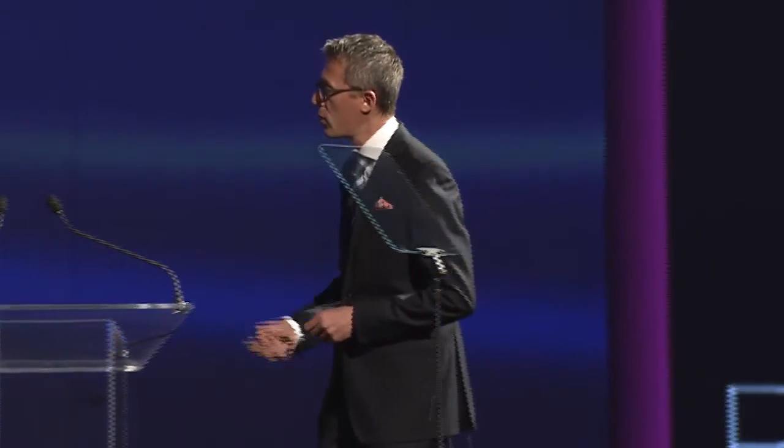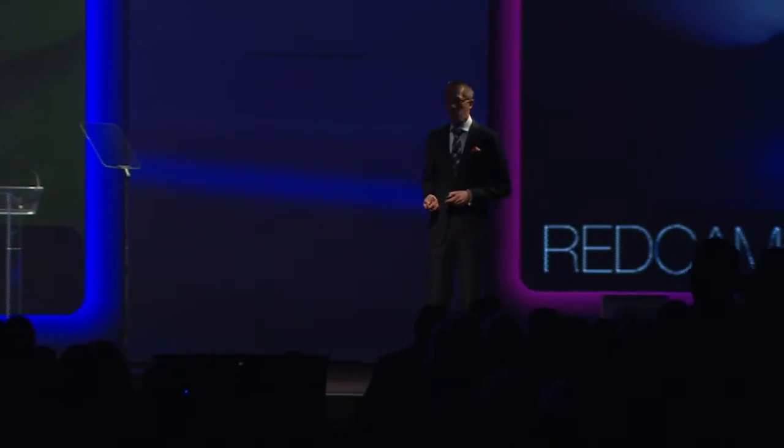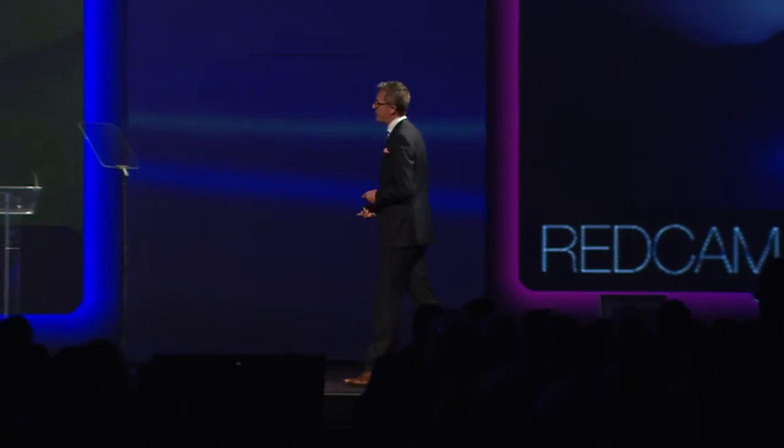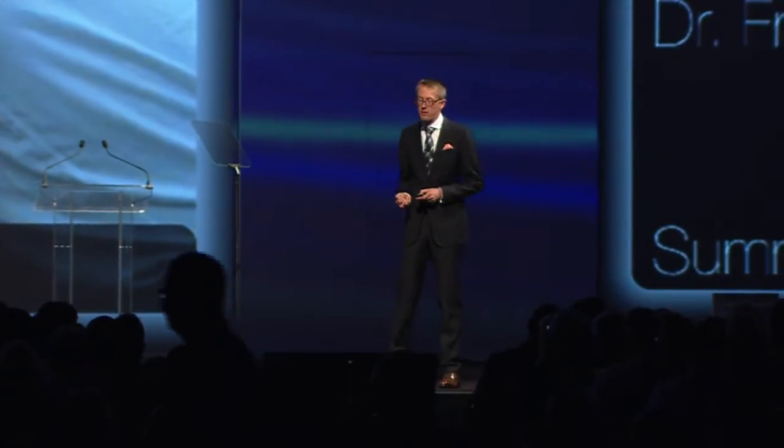from 95 to 2008. In 2008, 2009, the BlueCam camera was introduced by the Sirona company. And what did they change? They changed the light source. Instead of this infrared light source, they were using, and are still using, a blue light LED source for a better resolution when we are measuring our cavities. But we have to powder with both systems, and this was also always an aspect. We always wanted to have a powder-free camera.